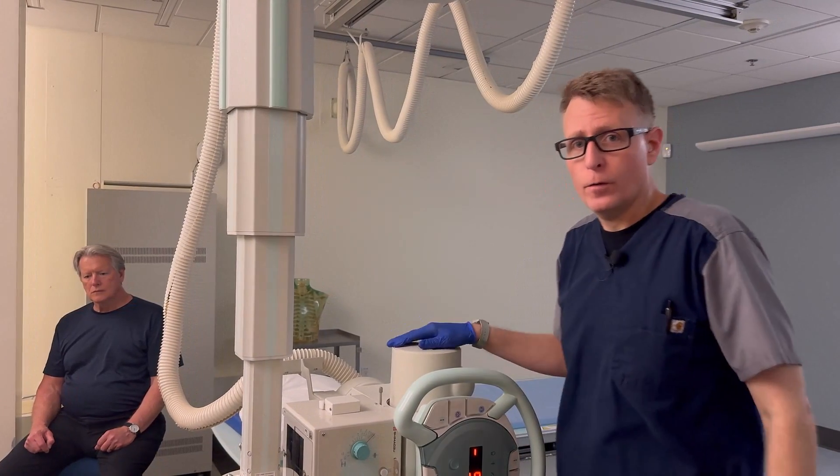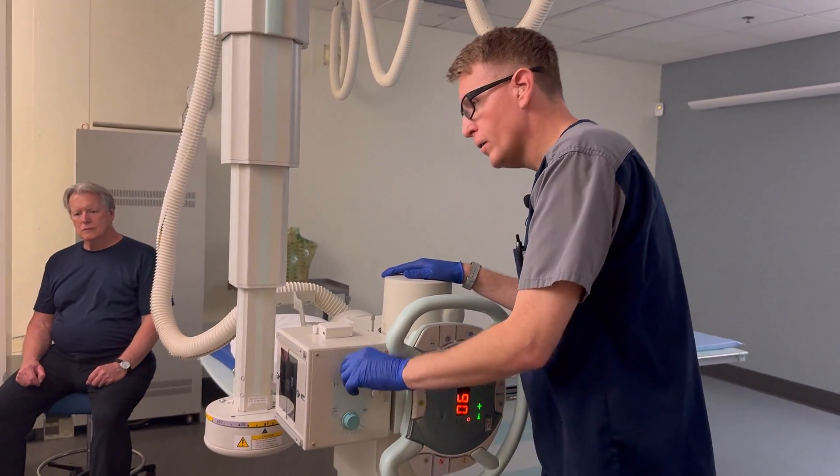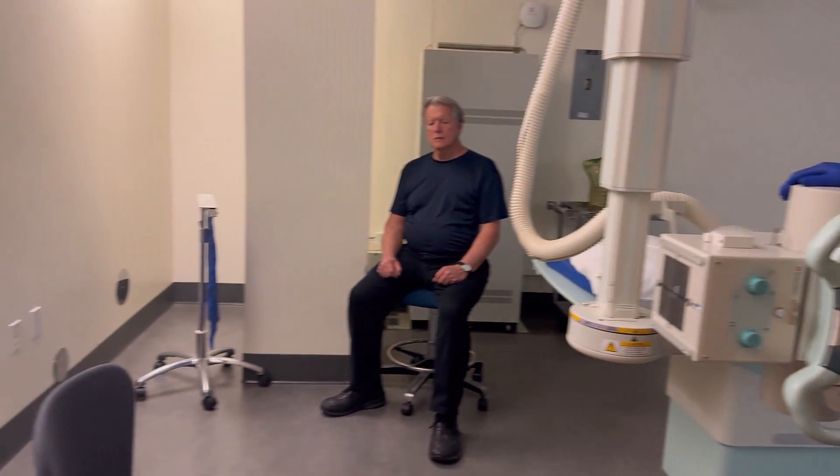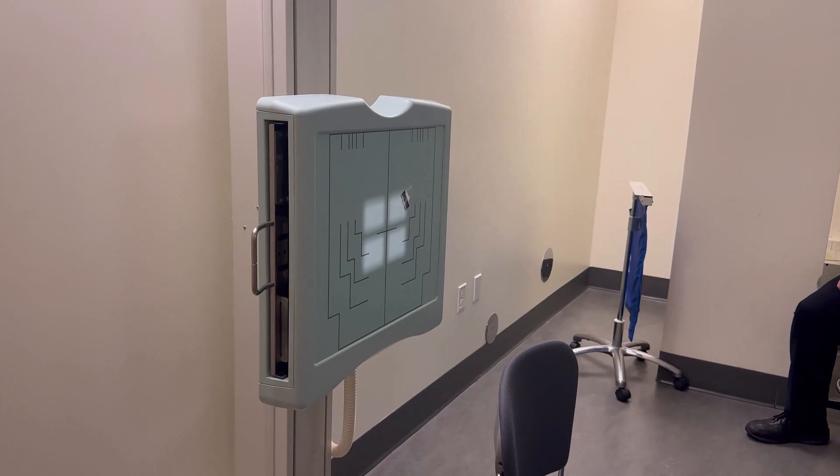So if you can frame it with those two landmarks in mind. I have a small, tight, horizontal collimated field. I can put my marker on in advance, which I really recommend.